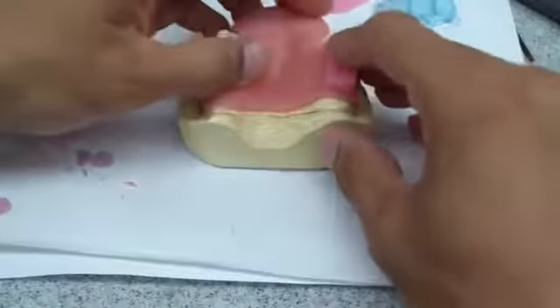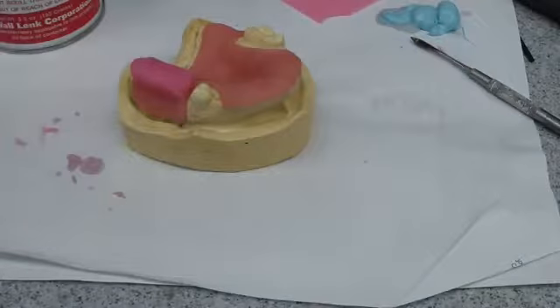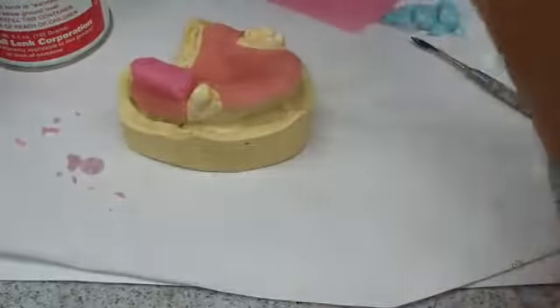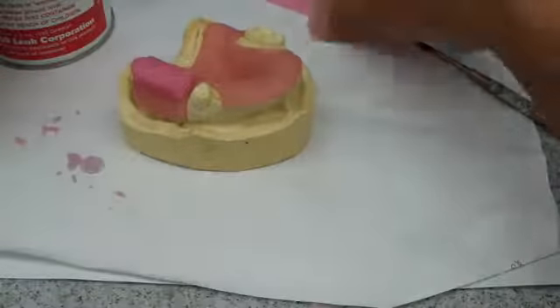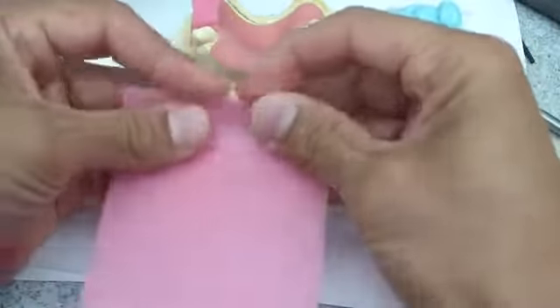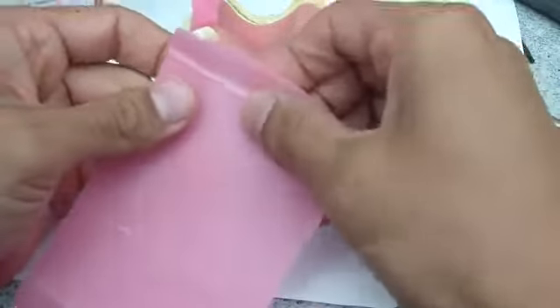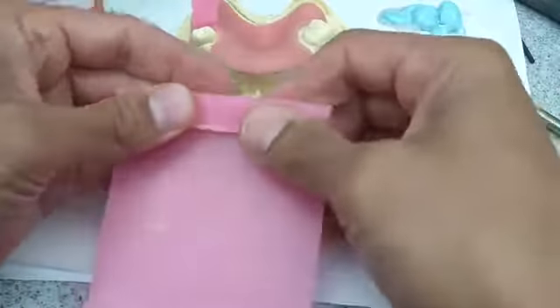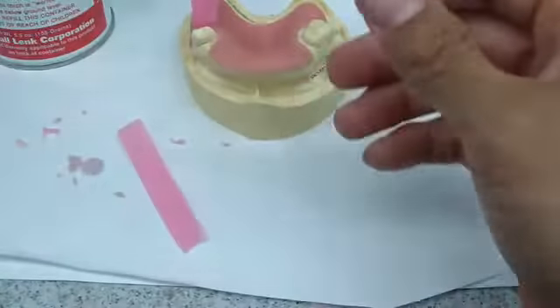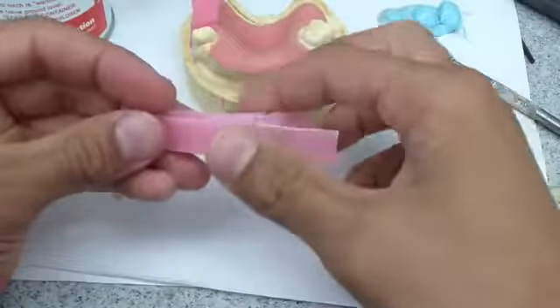So what we're going to do is just walk through placement of the wax. It's fairly straightforward. I'm going to light up my torch using regular denture base wax. It's right here. Fold it, and you can get these prefabricated. We have them, but for this case, you just need a really thin little piece. So I'll run that over the torch. You can see it's melting.